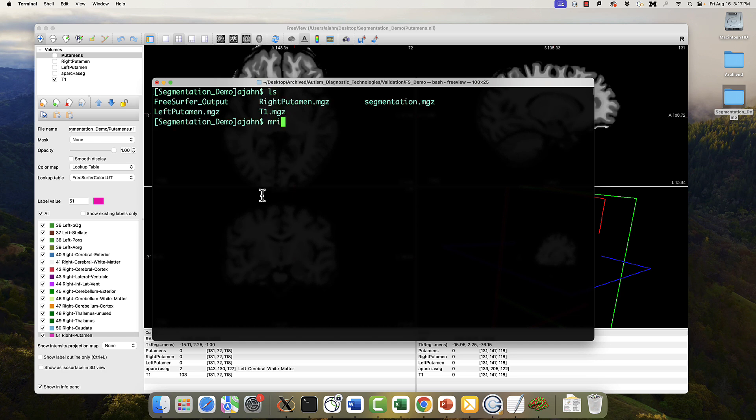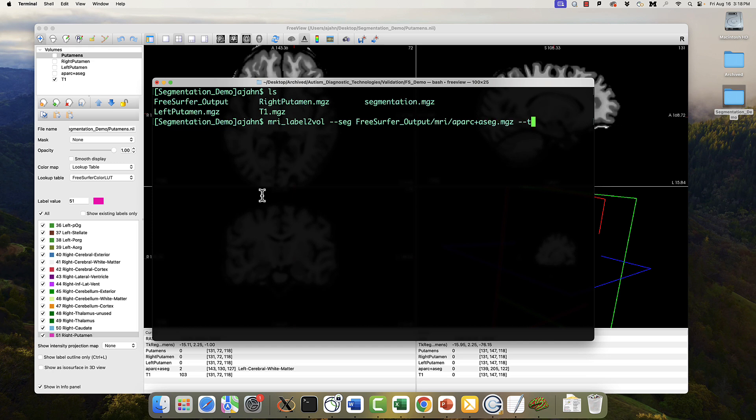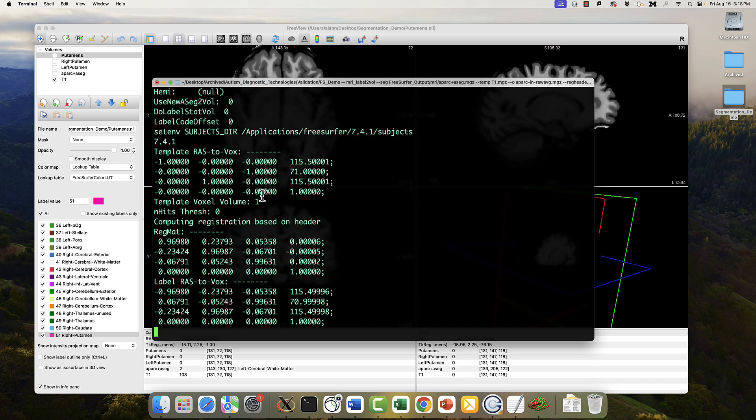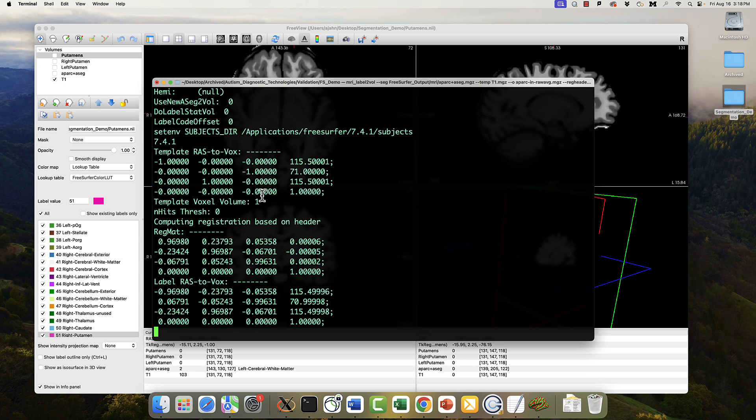Let's go back to the terminal. And first we need to make sure that the output from FreeSurfer, APARC plus ASEG, is in the same space as my native T1 weighted image. This is the code, you can also find it in the more info box down below. All I'm doing here is saying register the APARC plus ASEG image to my original T1 weighted image, just to make sure they're aligned appropriately, before I do any kind of dice coefficient similarity analysis.